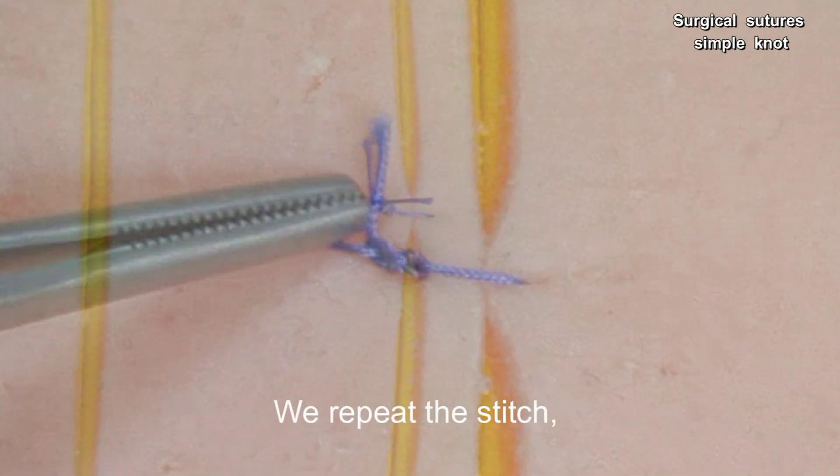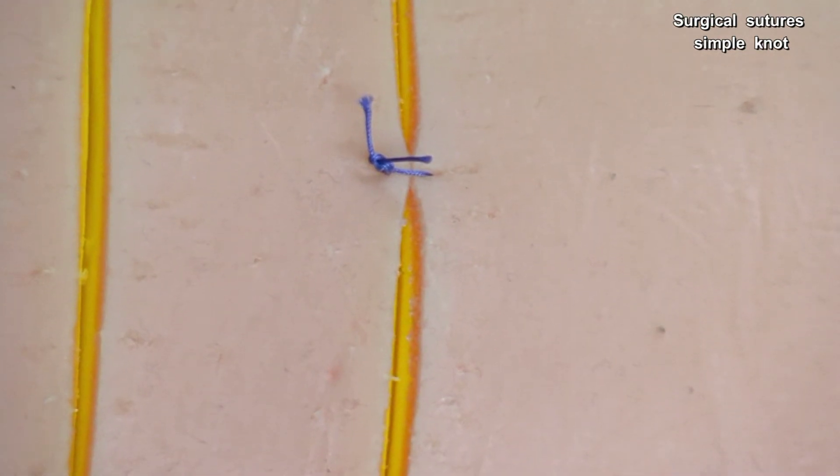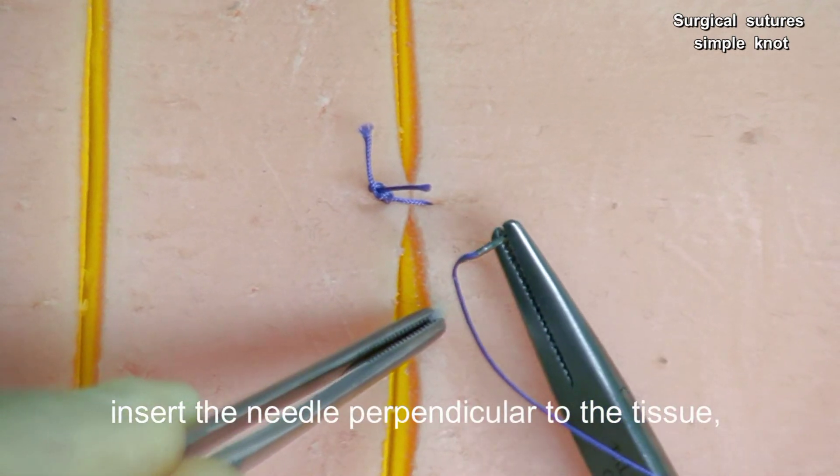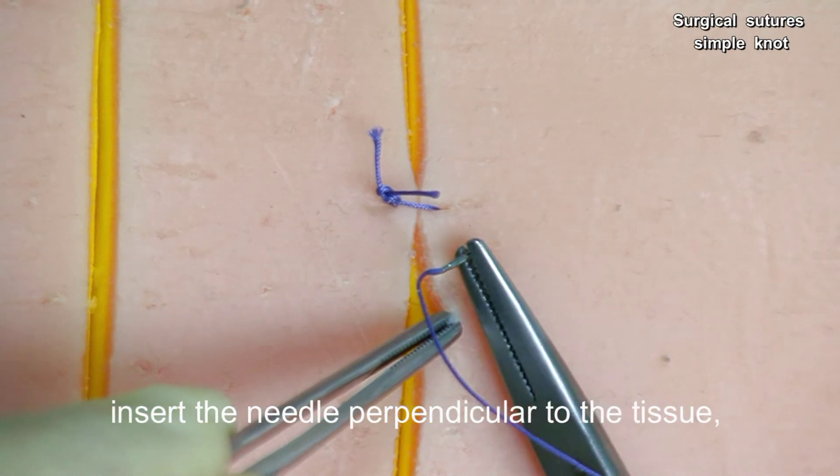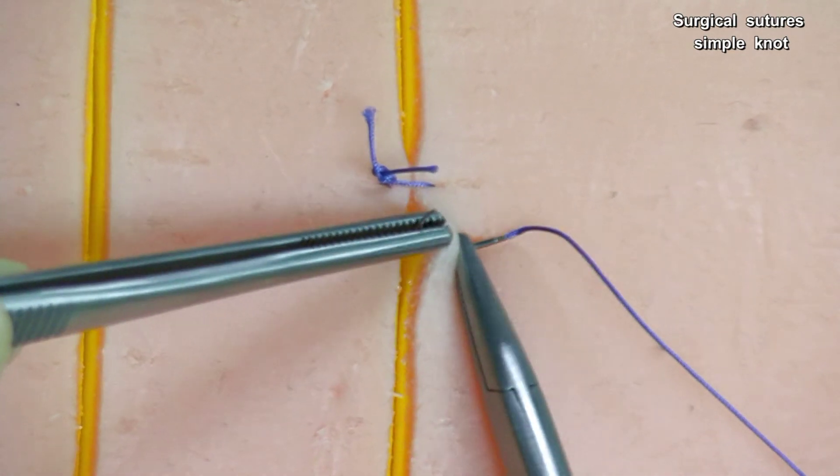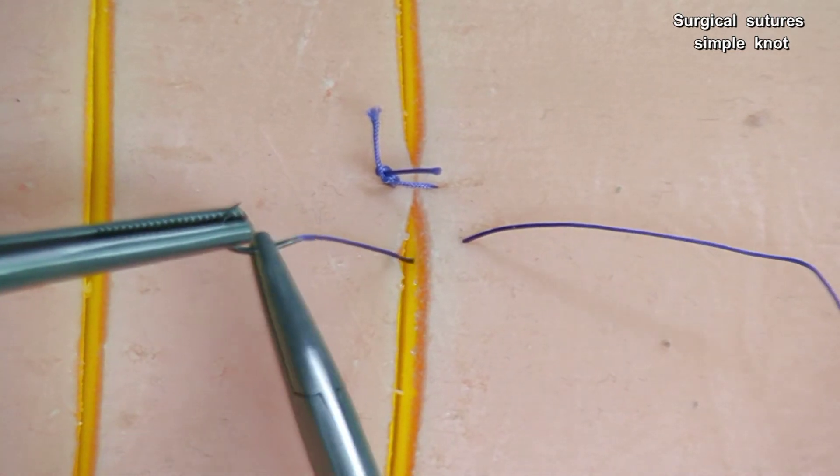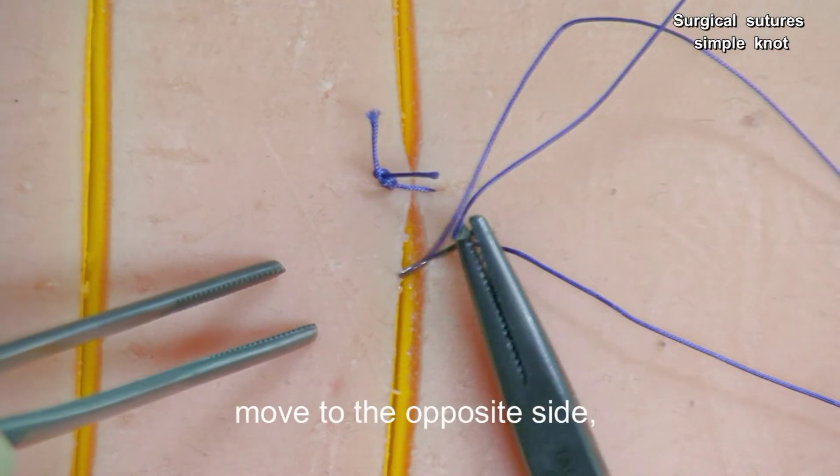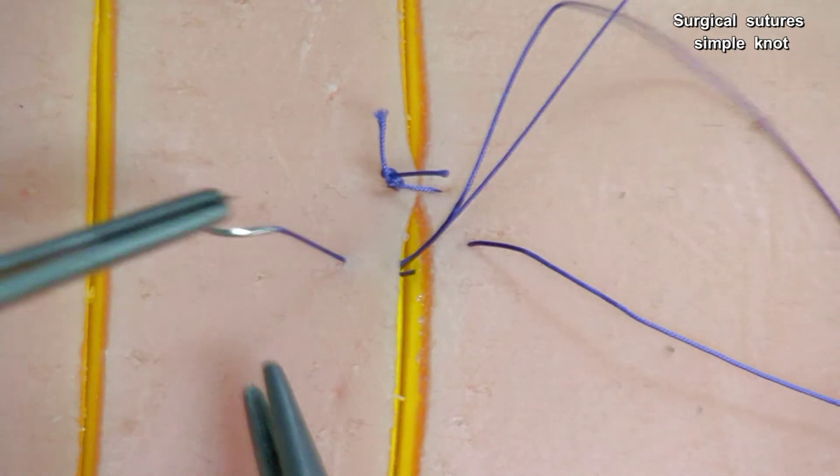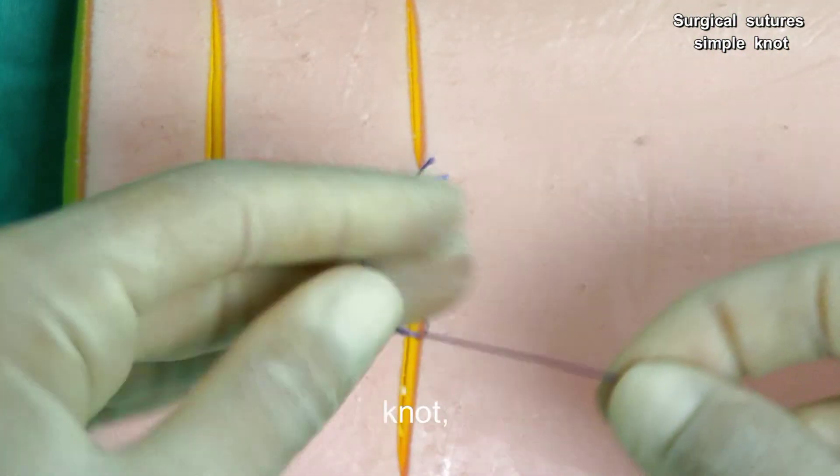We repeat this stitch. Insert the needle perpendicular to the tissue, move to the opposite side, bring closer, knot.